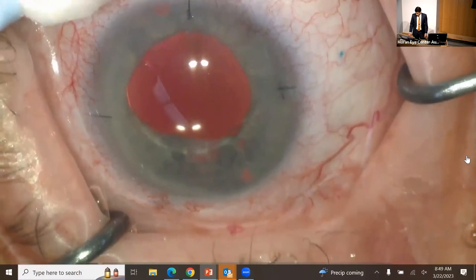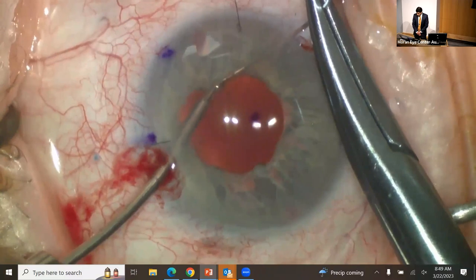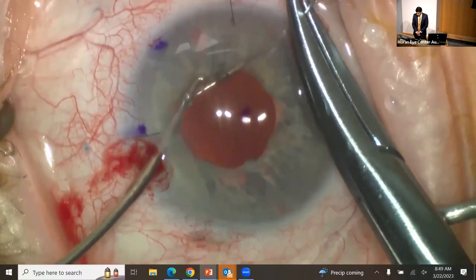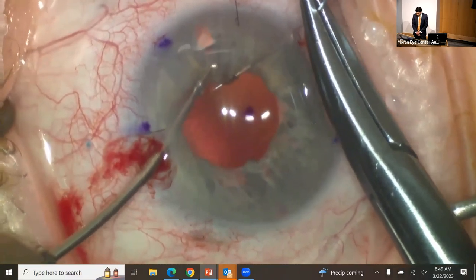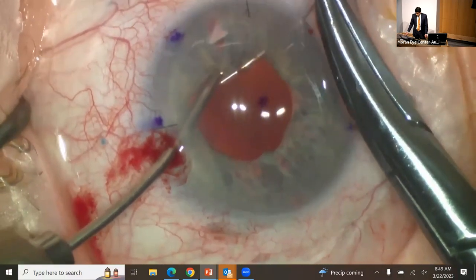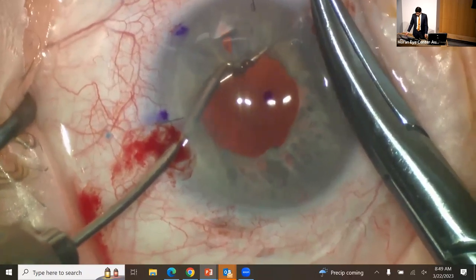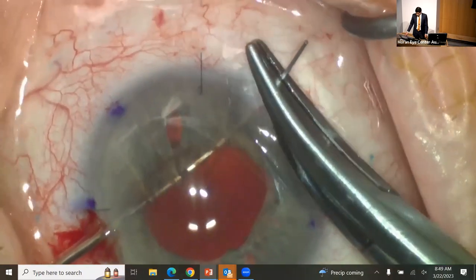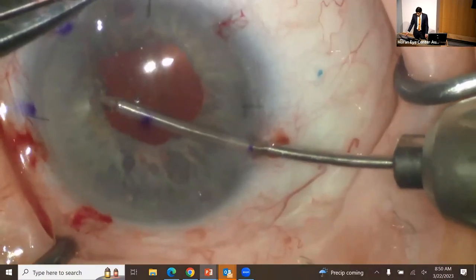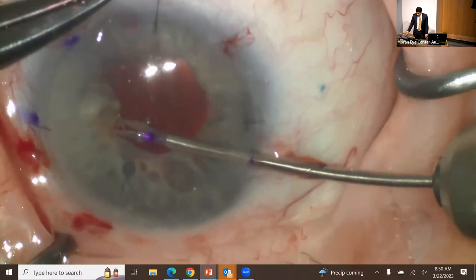Here I'll quickly show another quick video. We're using Prolene on a CIF4 needle and using micrograspers to place the iris around the suture needle. So that's done with one quadrant there. You can use an OVD cannula or another cannula of some sort to take out the suture needle. And basically you just continue this process.